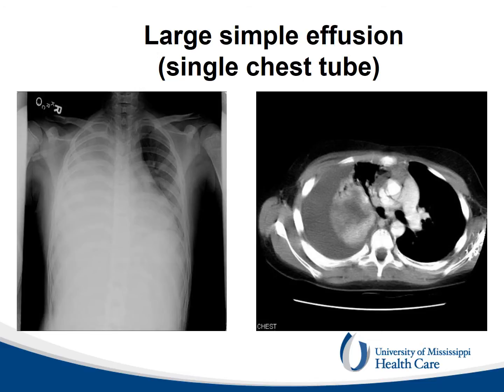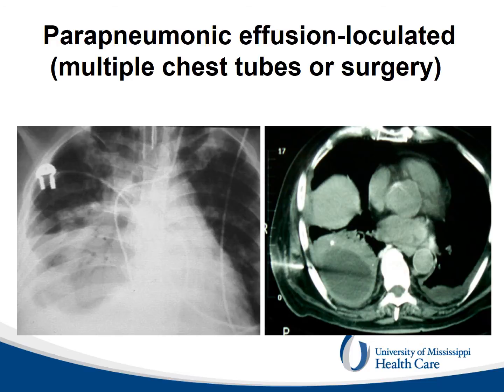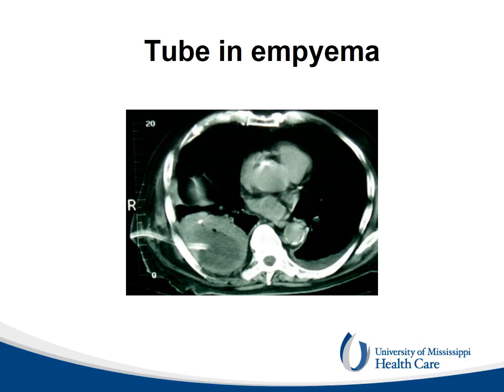Large, simple effusions are usually drained by a single chest tube, while multiple loculated parapneumonic effusions may need several drainages, enzymes for fibrinolysis, or a pleural decortication. An empyema usually requires a decortication to remove the lining of the infected cavity and re-expand the lung. A chest tube placed before surgery may reduce the toxic status and aid with the perioperative management.